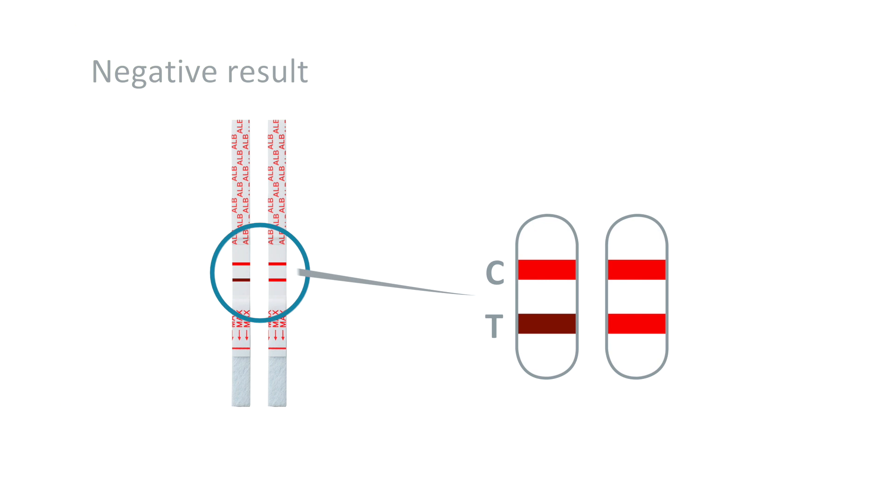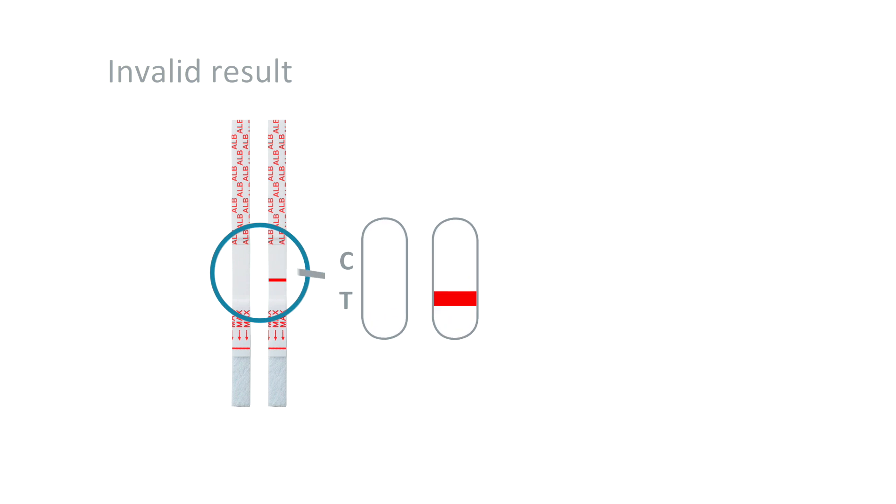Again, a control line signifies that the test has performed correctly and should always be present. If no control line appears, the result is invalid. Repeat the test with a new test device.